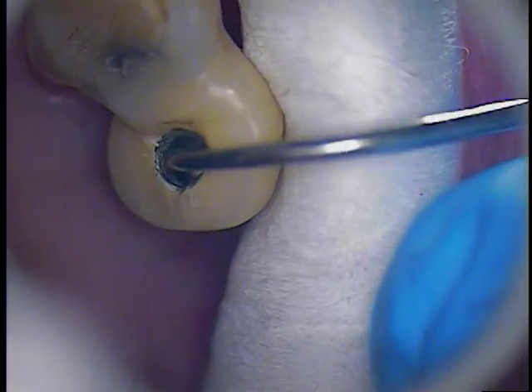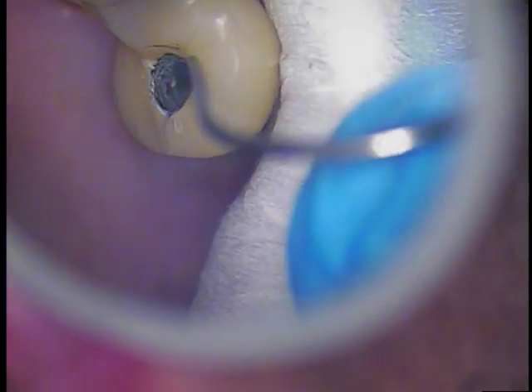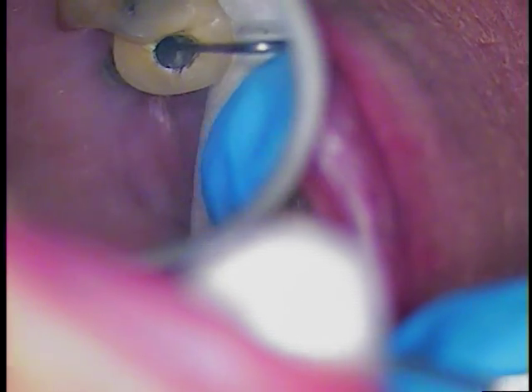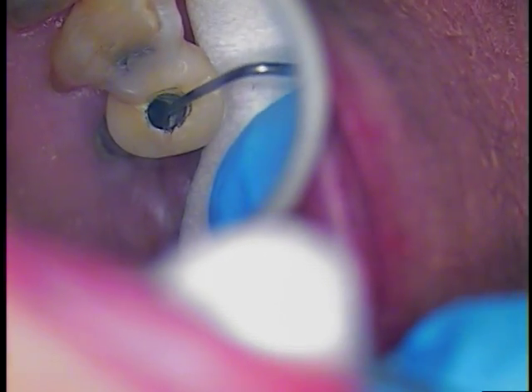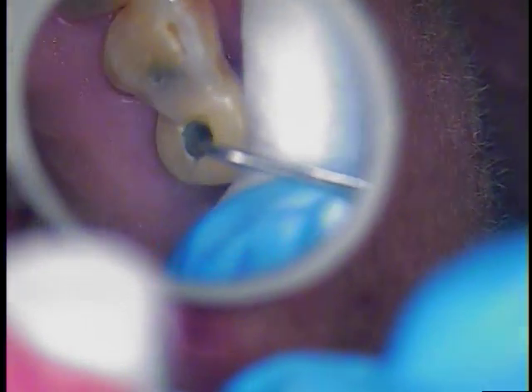We're looking straight in now and need to make more access to get all the way down there. I'm going to measure the length with the periodontal probe. That's 3, 6, 9 — so about 9 millimeters, maybe 10 millimeters — measuring approximately 12 millimeters to the base of the screw.